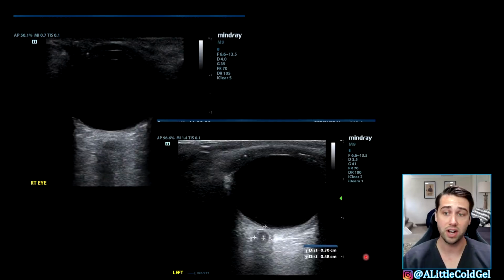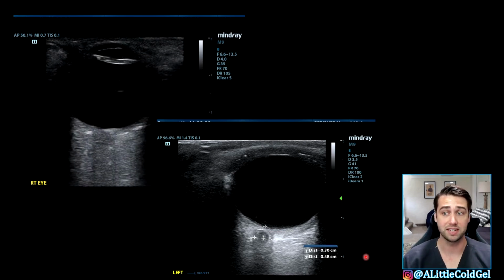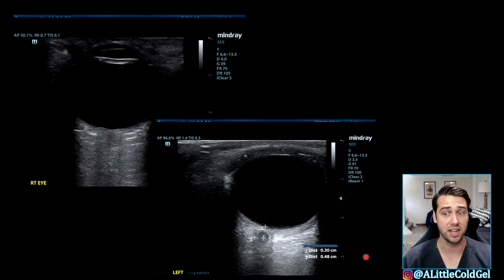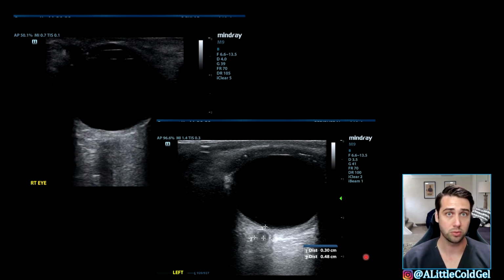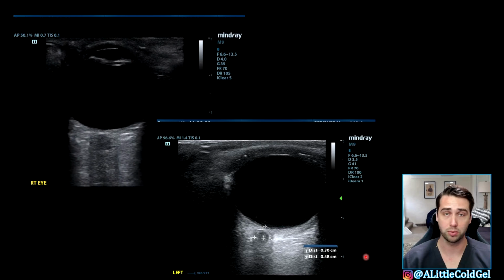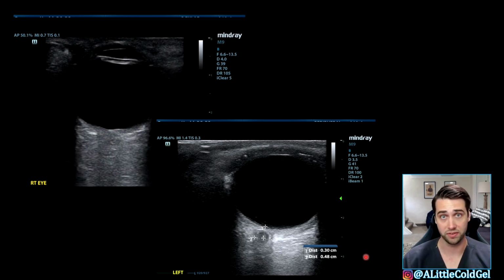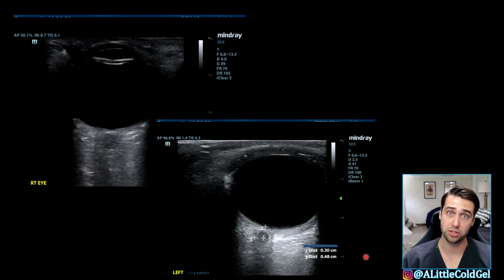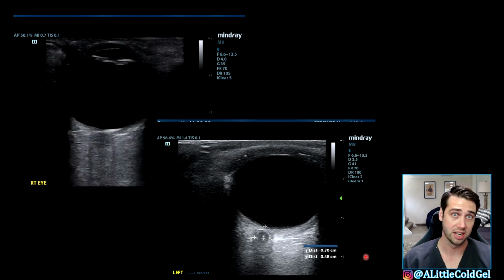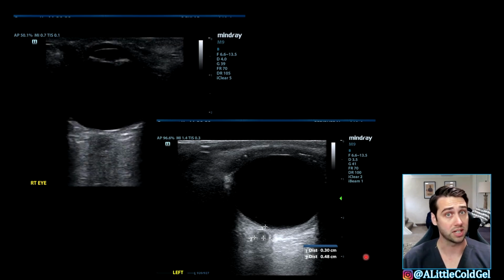Now, the last thing I want to discuss is measuring the optic nerve. And so if we have an optic nerve measurement more than 5 millimeters, that actually has a sensitivity of 90% and a specificity of 85% for an ICP greater than 20. Now, the recommendations have kind of been updated to look for an ICP greater than 25, but nonetheless, I find that this works pretty well, and there is a good amount of literature suggesting you can actually use ultrasound to track the progression of intracranial pressure in the unit and things like that.